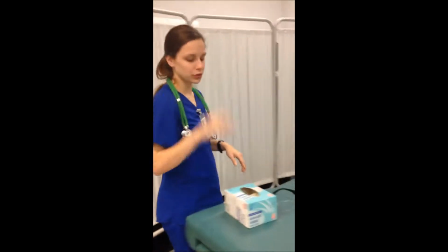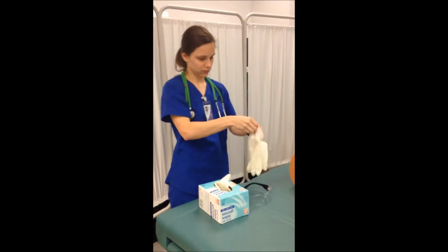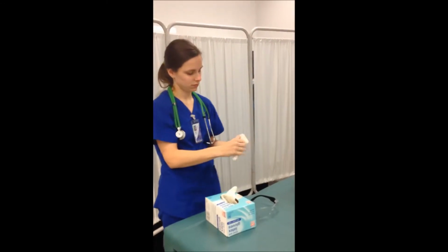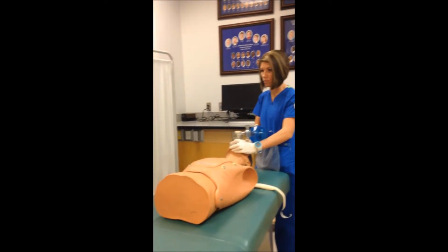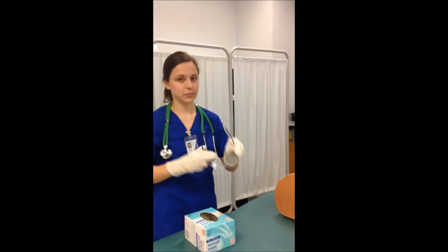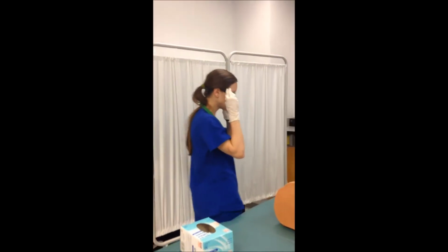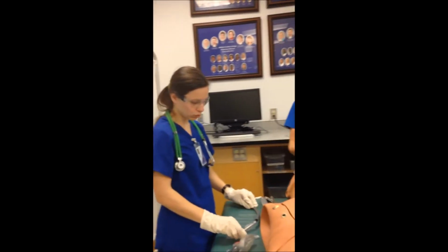I'm washing my hands. I'm back in the patient's room, gloving. And protective eyewear. Upon entering the room, I'm assessing all my tools.